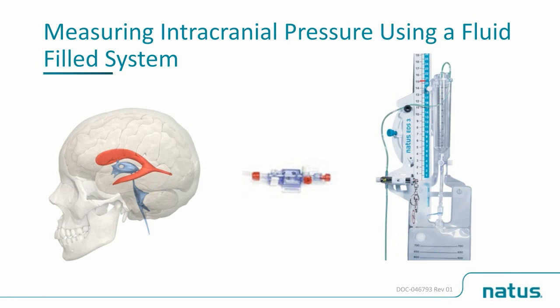Most of you are probably used to the following setup. A catheter coming out of the patient's head, connected to a drain with a transducer, pictured in the middle, connected to the bedside monitor to see the actual ICP number and waveform. Did you know that this is a fluid-filled system?